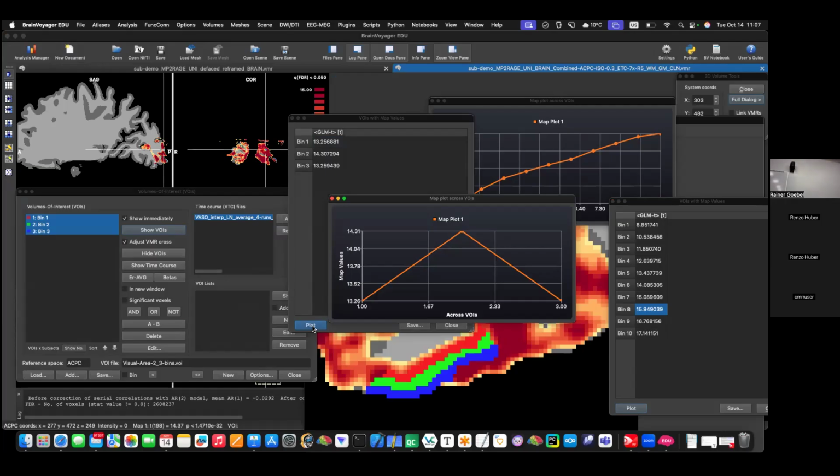So these are unique voxels, right? Right, the assignment of the layers. Yes, unique voxels. One voxel is assigned to one layer. The binning is exclusive. If you use the grids and create bins, you cannot have non-exclusive bins.